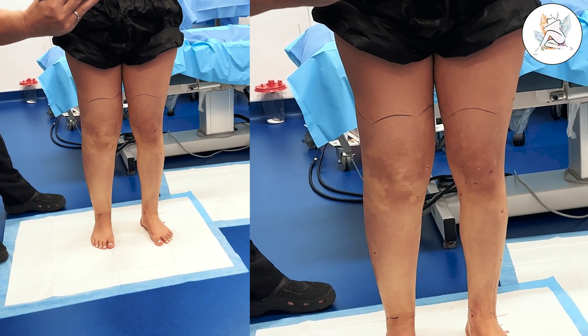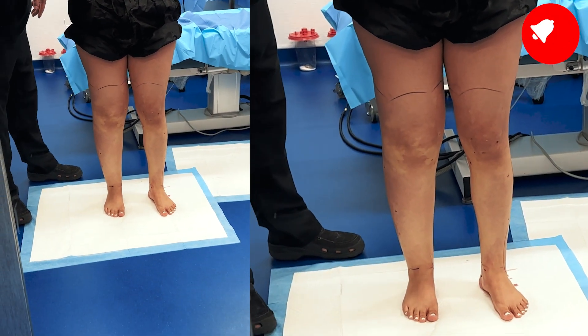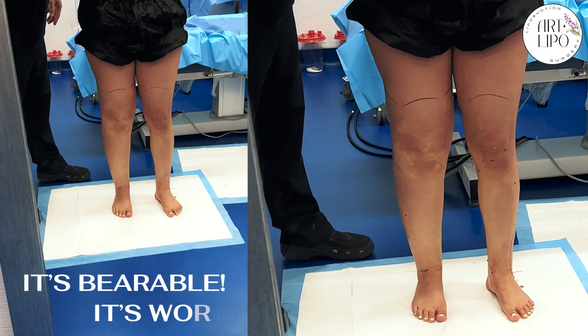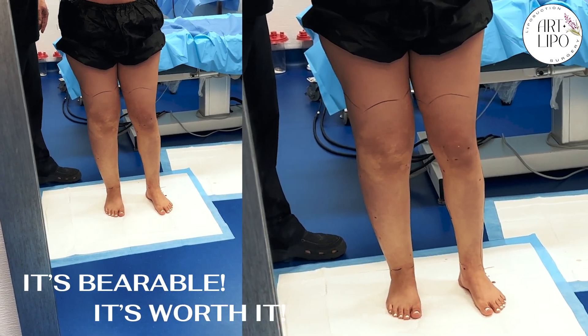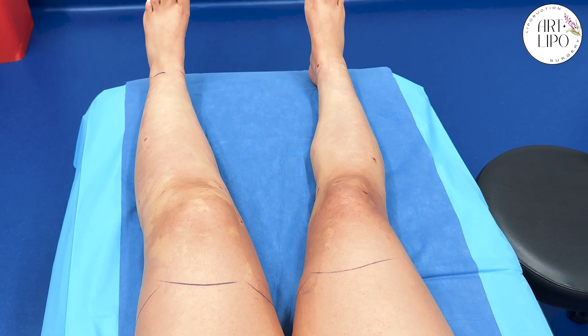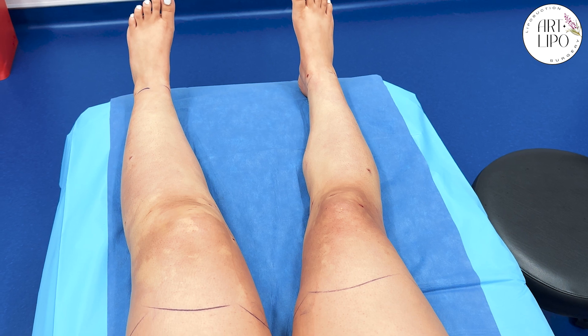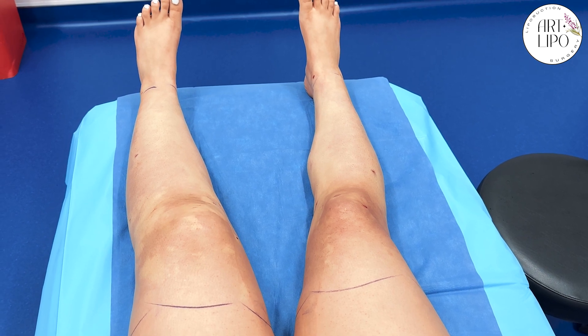So we already finished one whole side. How was the numbing part? It was a little uncomfortable, but it's bearable. It's worth it. I mean, in hindsight, it's like you're kind of holding your breath at times with the stinginess. Yeah, there were moments where it was a little uncomfortable, but it's really bearable.